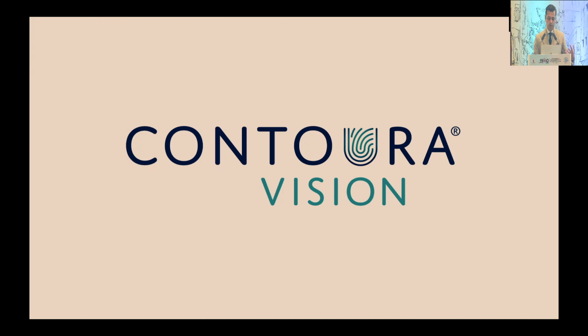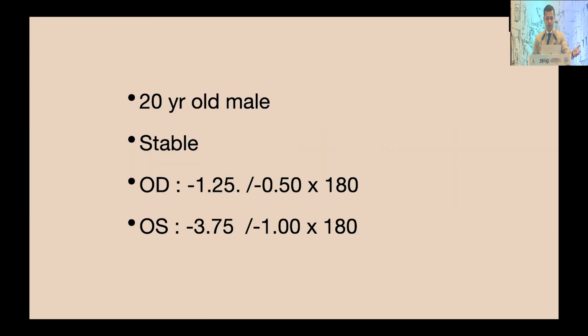We looked at the topography and we treated the cornea based on topography. Now, later, a few years down the line, it started coming up as what is known as contour vision or topo-guided treatment. So we all realized that what we could do with bad eyes, we could do much better with eyes that are pristine and good. Not only treat the numbers, but make their corneas better.